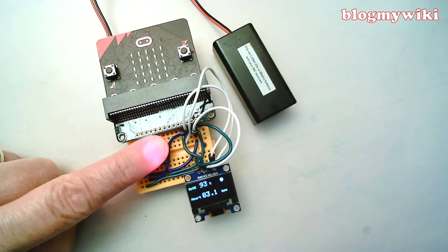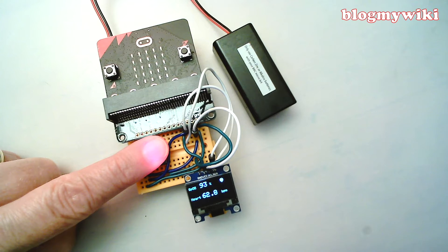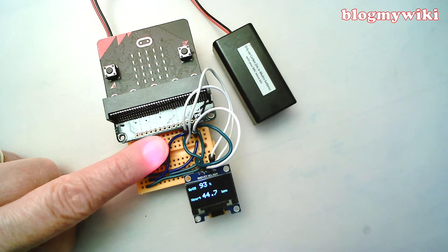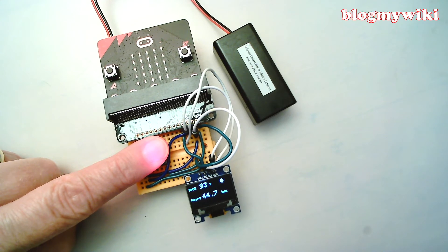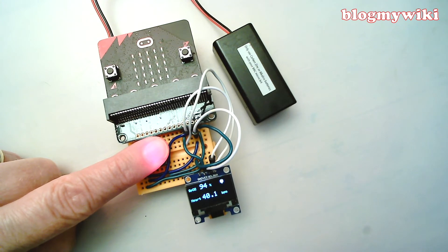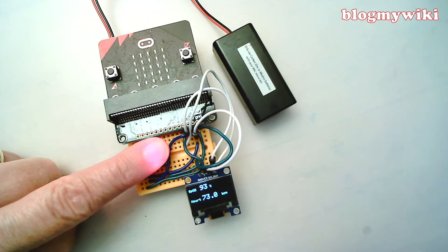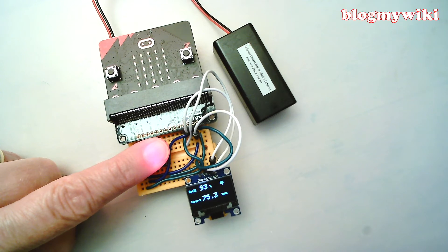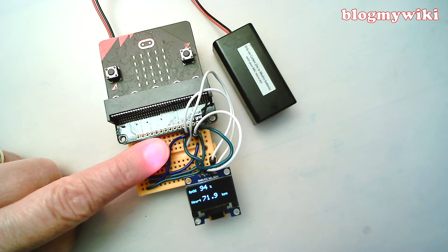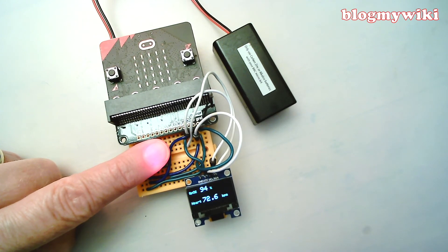And my heart rate is kind of all over the place a bit at the moment. But if you use your thumb and hold it down for longer, you get a more regular reading.